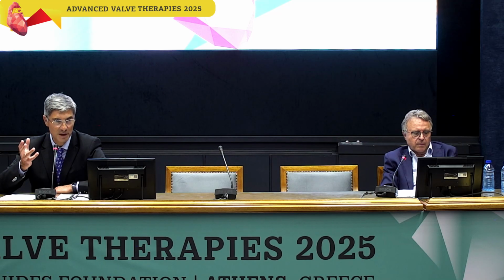So he ended up rupturing the aortic annulus. So this is something that you should always pay special attention to, because maybe you cannot get away with it. But definitely there was at least moderate AI. At that time we checked, and the AI index was 28. So we left it alone. But in the next follow-up year, you will see that there is deterioration of the clinical status of the patient, so we needed to do something. I think that this is a good approach. We need to be able to tackle these cases and maybe not be afraid to place a plug when there is a need.